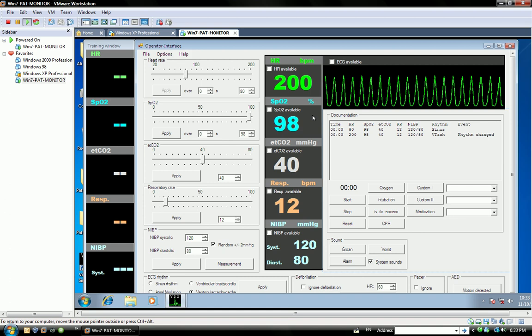But 95 is okay; 94 or below is low SpO2. A level of 80, 70, and most critically 60% or 40% is extremely critical for the patient's oxygen. When the patient is not receiving enough oxygen, the SpO2 will fall to around 70%.